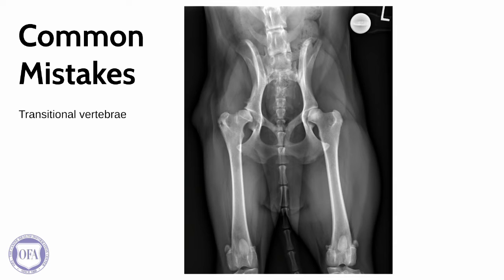While the pelvis is relatively straight, as indicated by relative symmetry of the obturator foramen and ilial wings, indicated in blue, the spinous processes of the caudal lumbar vertebral column are off-center and are located towards the right of the vertebral body. In these cases, it is more important to evaluate the positioning of the pelvis and the straightness of the pelvis rather than relying solely on the vertebral column.